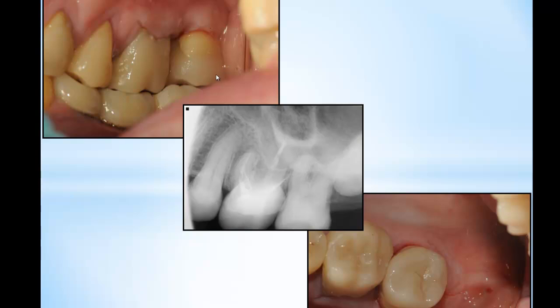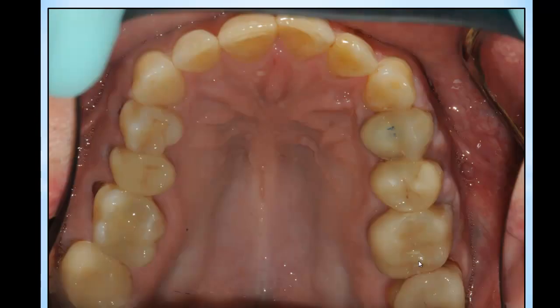So this is the restoration. I've been using e.max in this case. You can see there are no gaps, and this is how it looks in the patient's mouth. So this was the last restorative stage from a Cerec view. It has some small cavities at the cervical that I have to work on, and a little bit on number 10, sorry, the incisal edge. But you can see that's my dentistry within 5 years, some good restorative work and some of the bad, but that's my experience with the Cerec for 5 years.